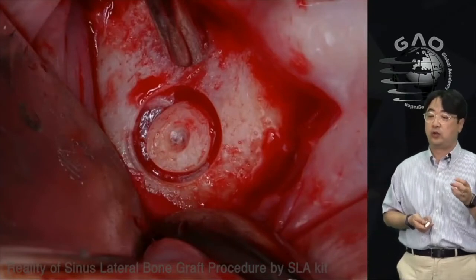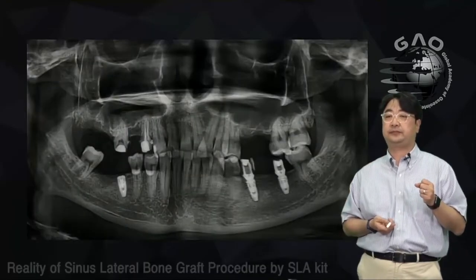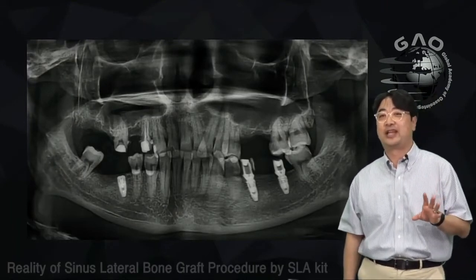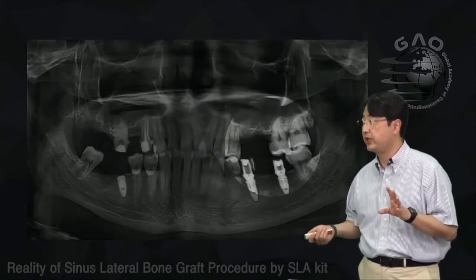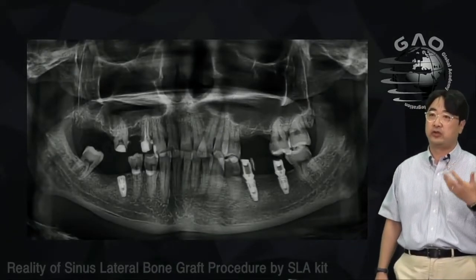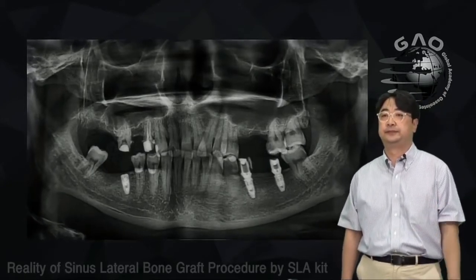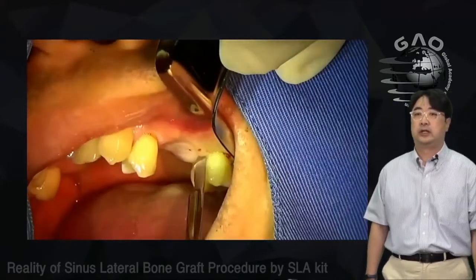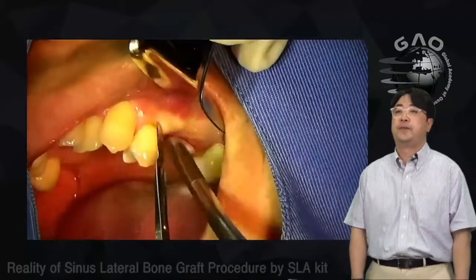Now I'm going to show you a real clinical case — one of my patients who needs a dental implant on the left posterior. As you can see, there's not much bone for implant placement, so we'll definitely do a lateral sinus bone graft. I've encoded the video a little faster.